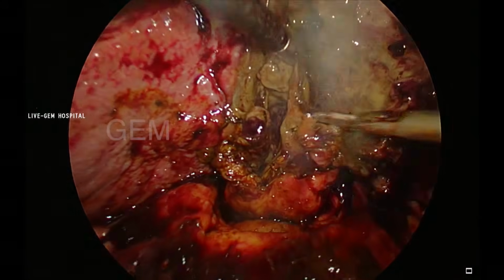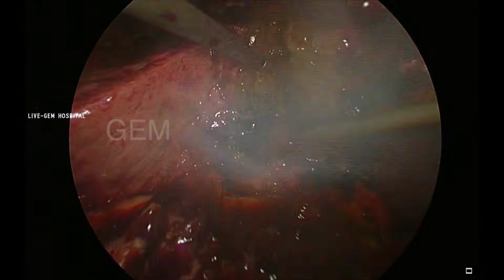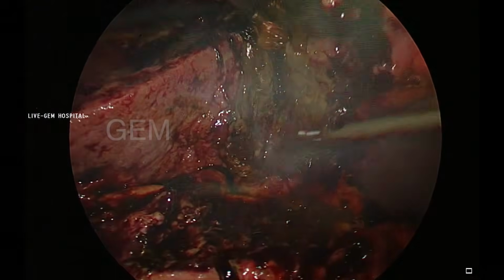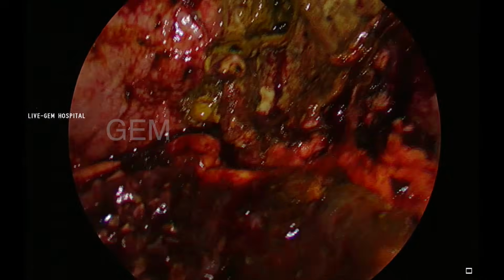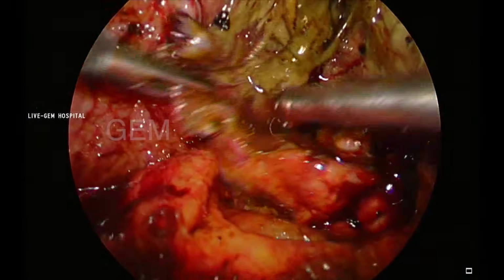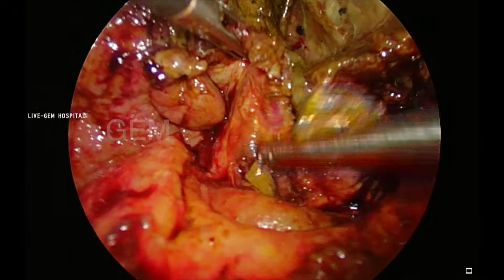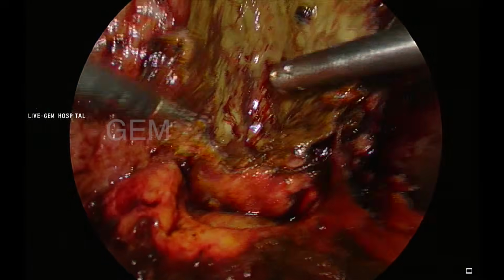So all the infundibular mucosa is being removed, and then it is excised using the ultracision forceps. Check. You can see there is no green color covering of the infundibulum. So still some green color is there.